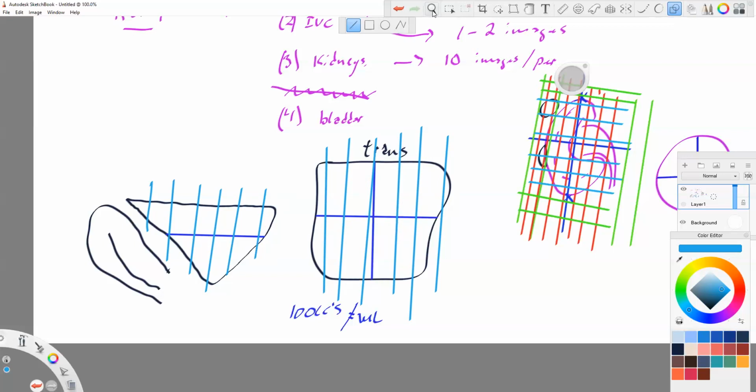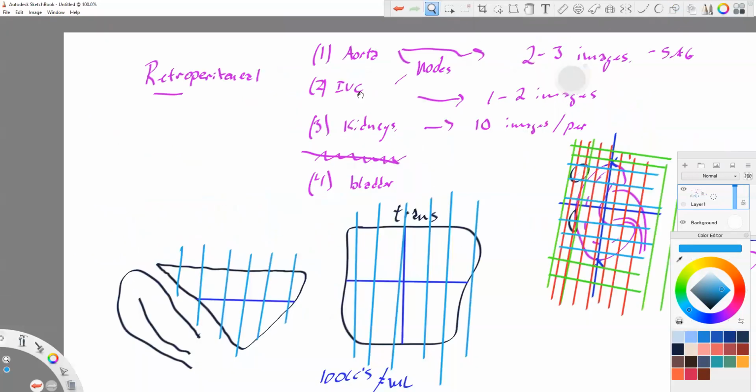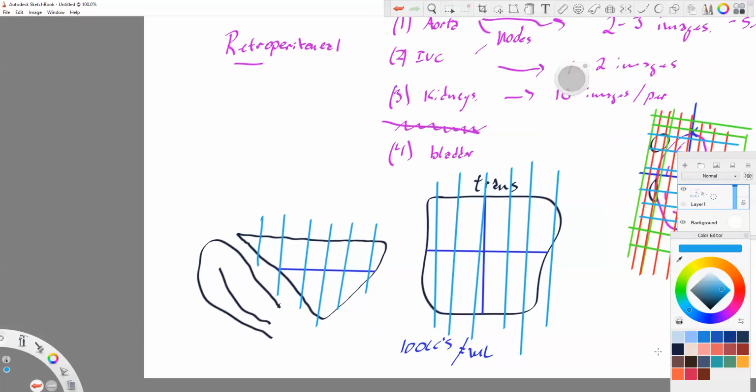And then the last thing we want to look at, and generally in transverse, so let me redraw the bladder here. I'll put it over here. We're going to try to find the jets, the ureteral jets. Now, a lot of times we go looking for, there could be a lot of posterior bladder, and of course the jets come in from the posterior surface, right? And so where do we find that? So let's kind of draw our square-ish bladder here.